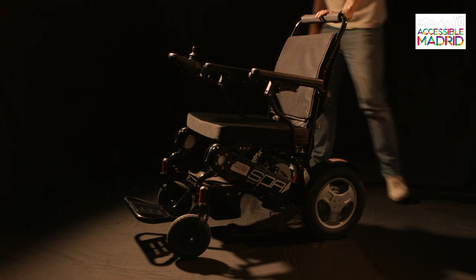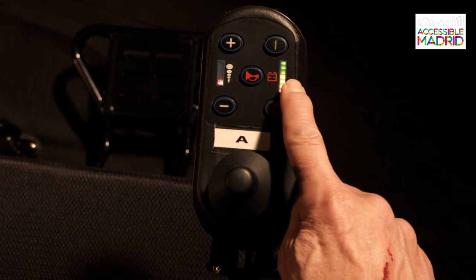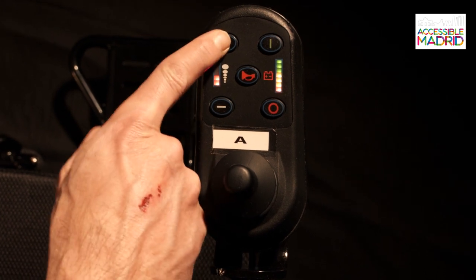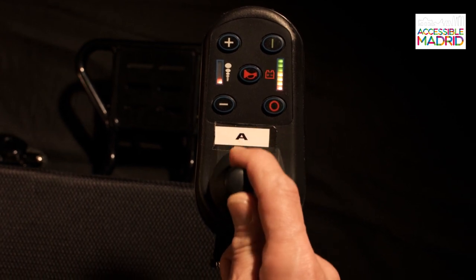With the clutches in the direct position, we will turn on the chair by pressing the power button. The chair has a battery charge indicator, a horn, one button to increase speed, and another to reduce it. With the joystick we can drive the chair in the desired direction.